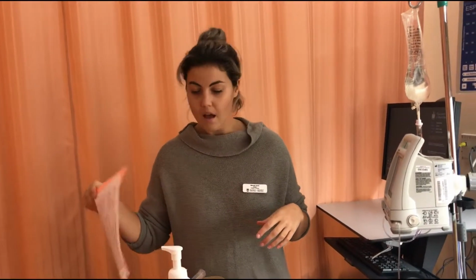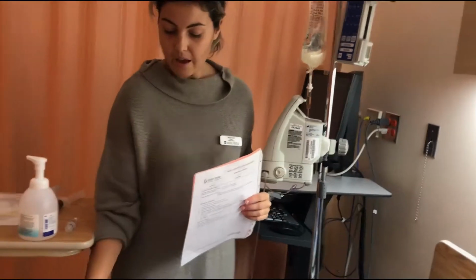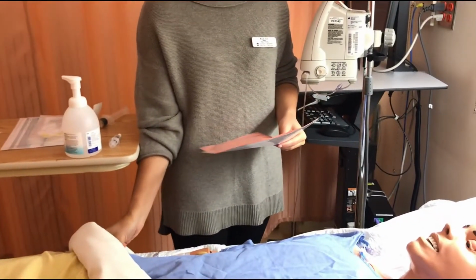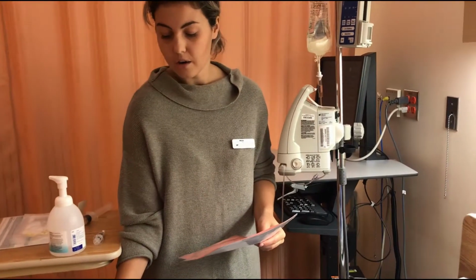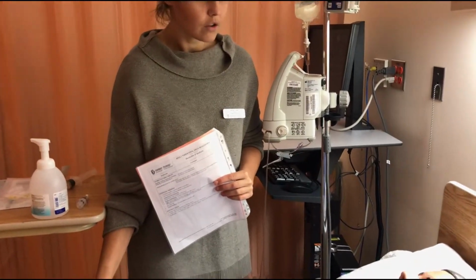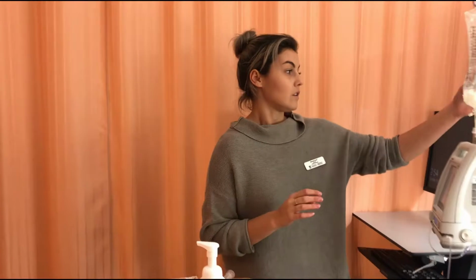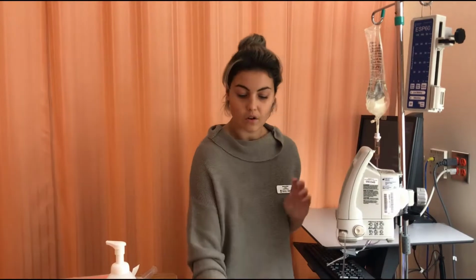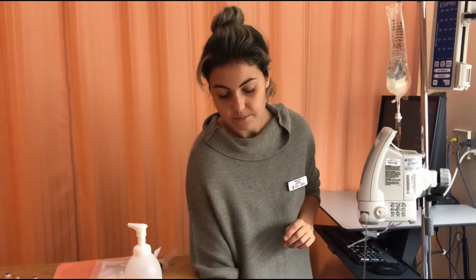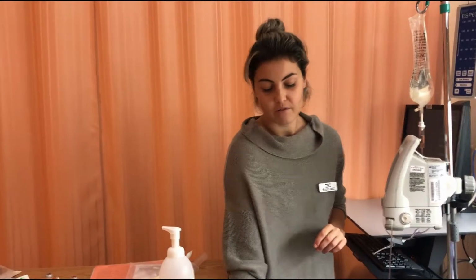I'm just going to ask the patient if she can repeat her name for me and her birth date, 2 identifiers, and I'm just going to identify also that the allergies on the MAR match her wristband. And can you just confirm your allergies for me? Okay, yes, thank you. I'm also doing a safety check as I enter, assessing whether or not there's any issues in the room, and if the IV is already running at the right rate, and that the IV is patent, and there's no signs of phlebitis or infiltration or infection.